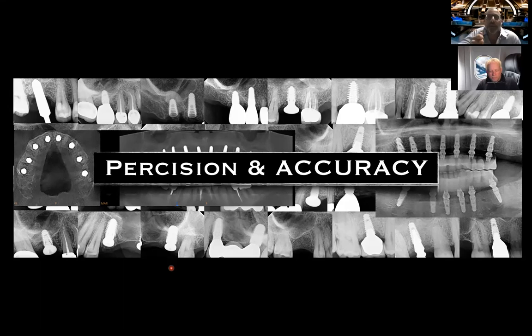And that's the key. Our patients are coming to us for teeth. How we're going to deliver them is up to us. So we have to look at the best manner to which we can deliver that. Sometimes that may be a static guide, and sometimes that may be free-handed, because the patient needs an implant that day. And other times you don't necessarily have a navigation system. And other times it's going to be using virtual navigation.